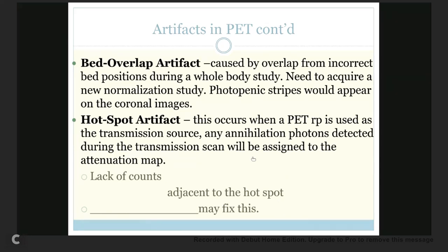Okay, so scratch that. Put your attenuation correction / filter.